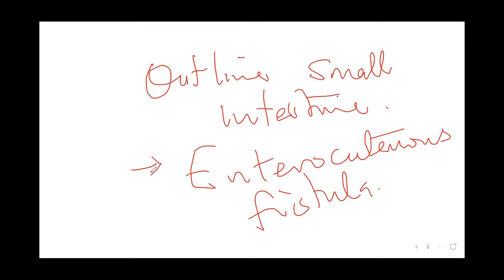You might find it difficult to cannulate the tract of that fistula to inject a contrast. So it is easier for you to do a barium study to see if the contrast will leak onto the skin, okay? And of course, if it is an end fistula, you know it will not pass to the distal segments of the bowel. So you can also employ a barium meal and follow through in some enterocutaneous fistula.